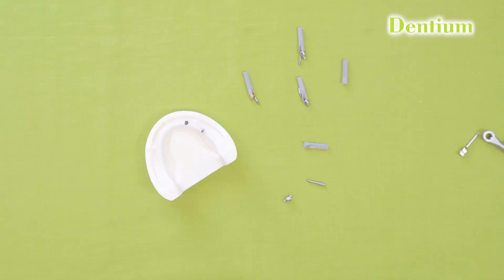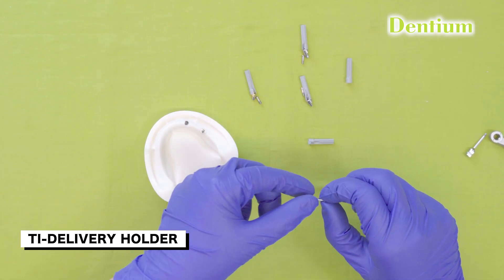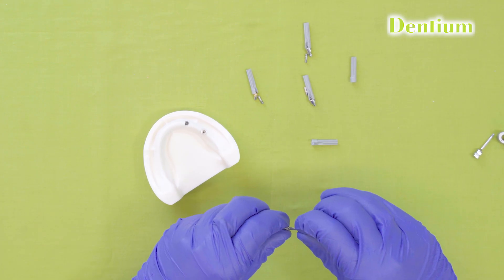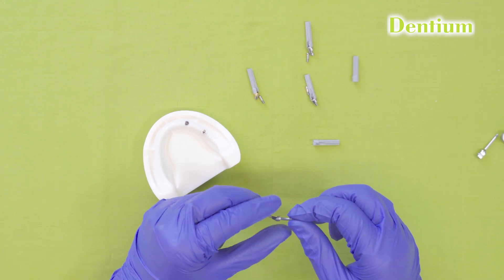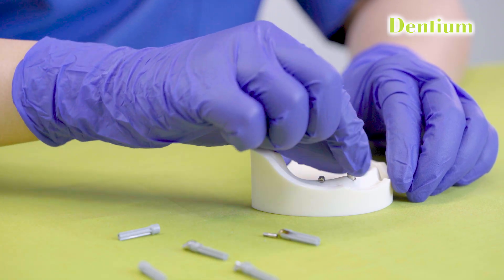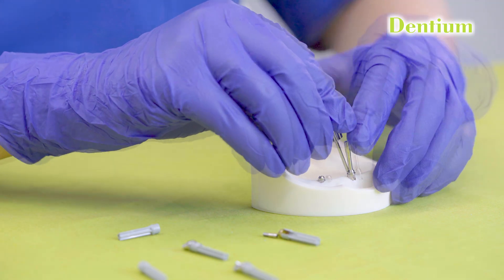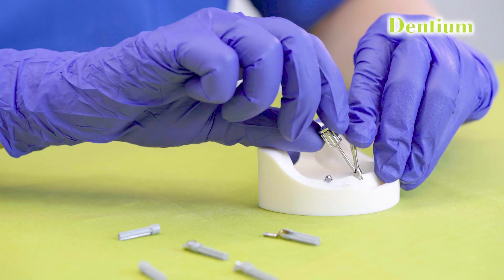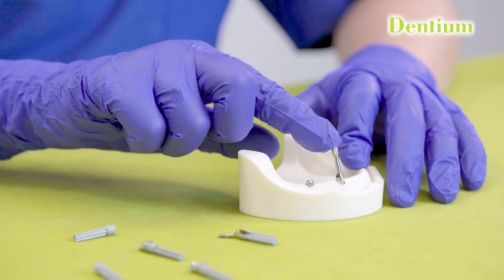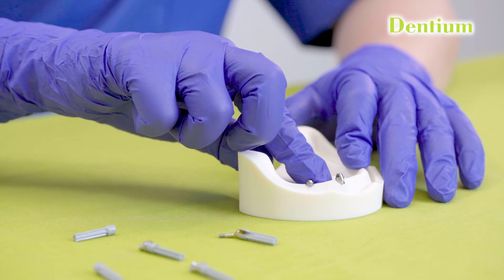If we are having any difficulty working with the plastic delivery holder, we can use the titanium delivery holder available in Dentium. We can simply screw it over the top of the multi-unit abutment, position it over the implant, and screw the multi-unit abutment screw with the help of this hex driver. After complete placement of the angled multi-unit abutment, we will remove the delivery holder by simply unscrewing it.